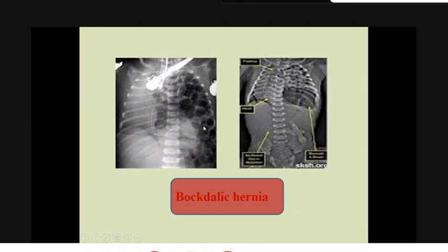There may be malrotation of the bowel loops due to difficulty of normal rotation because of the diaphragmatic defect. The diagnosis may be difficult on chest x-ray or on plain abdominal film if the herniated content is the liver or spleen or the bowel is still fluid filled. We said the presentation is in early infancy.